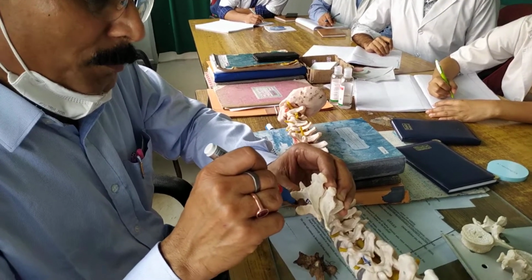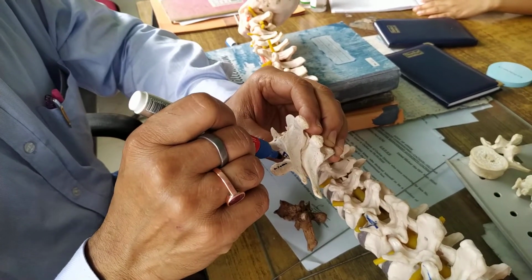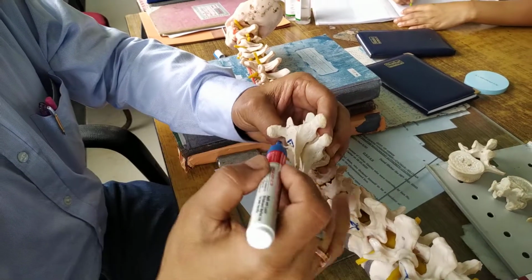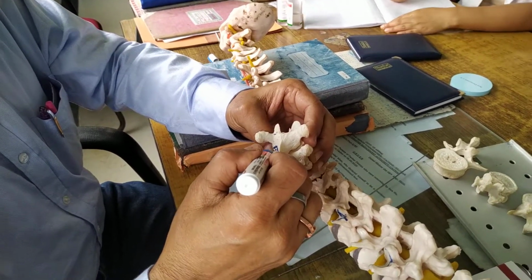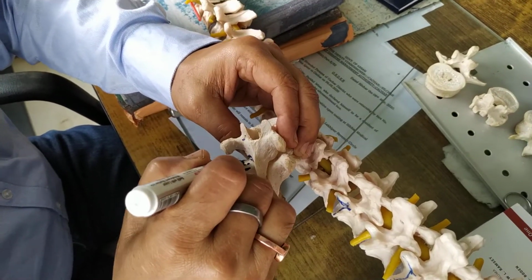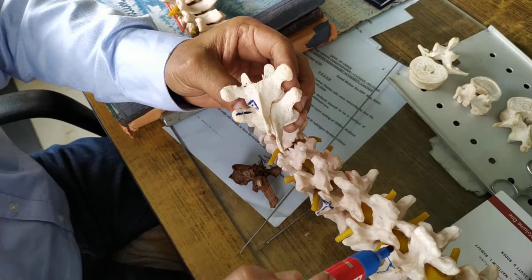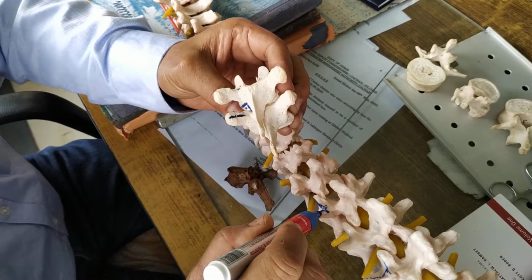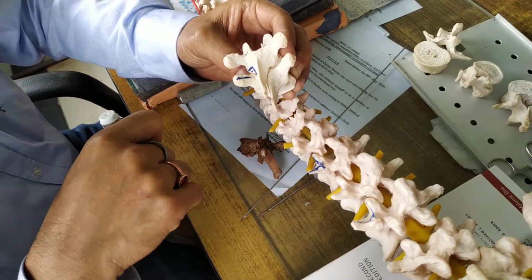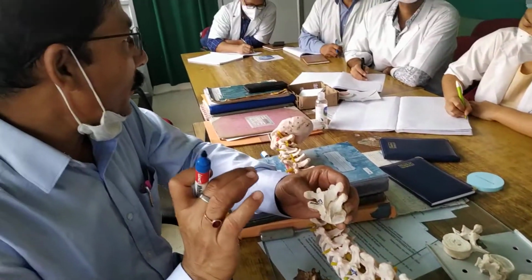But here, you are going to have a three-part division. That means you are dividing the transverse process into three equal parts with two lines. So I am going to divide the transverse process on my side into three parts. Correct? Yes or no? Unlike in the lumbar vertebra, where we only divide into two halves with the midline, here you have to do the dissection and divide into three parts.